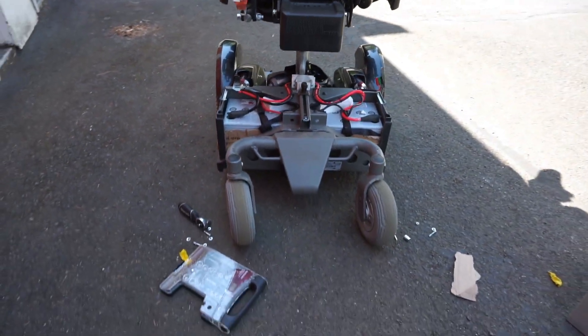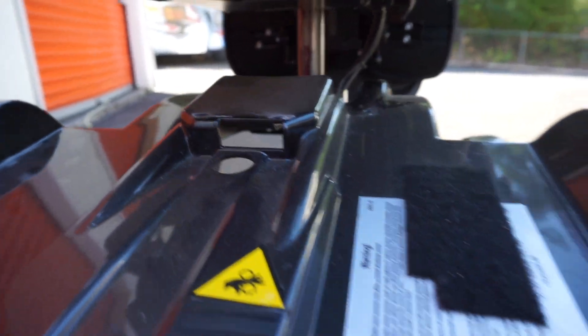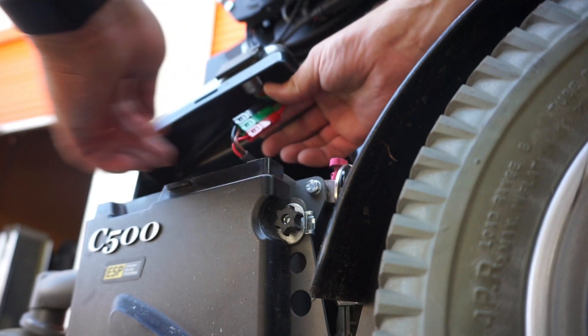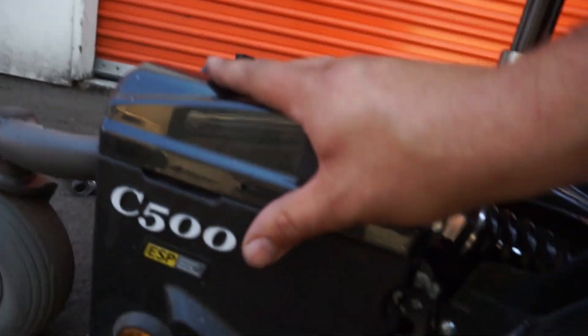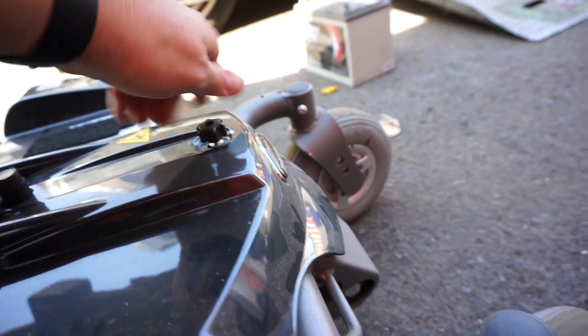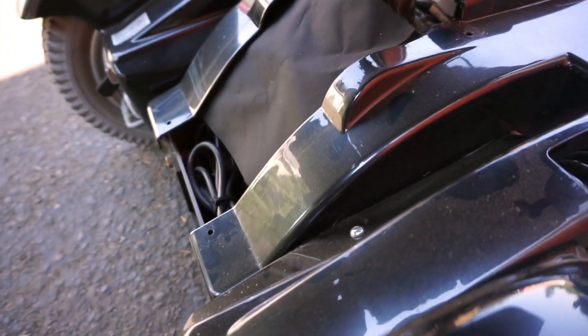Here's what it looks like from the back with the cover removed — you can see the left and right batteries. Let's stick that thing back on, just slide this right on here, then go around to the other side. Remember to reattach your auxiliary charging port — just line up the colors and put it back on. You should have a seat stabilizer. Then this side will snap on, and tighten down the rear thumb screw. Make sure these little pieces of fabric are still in here properly.